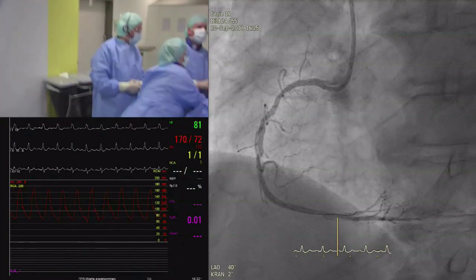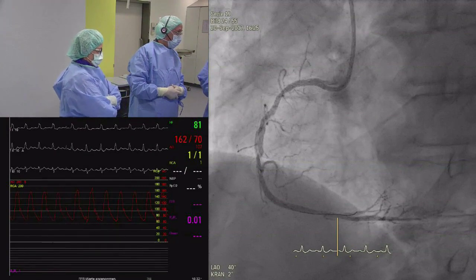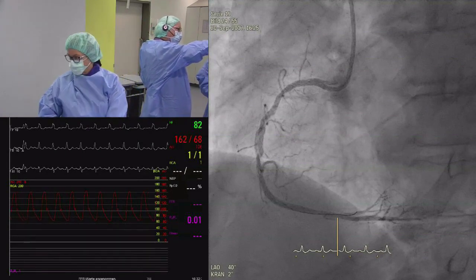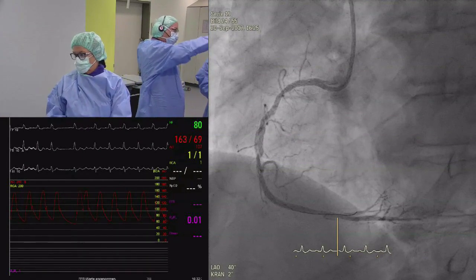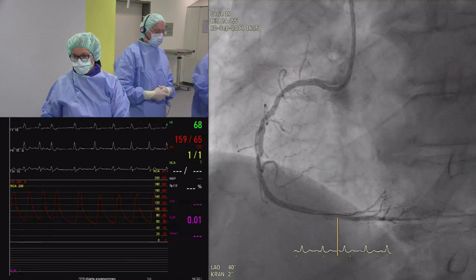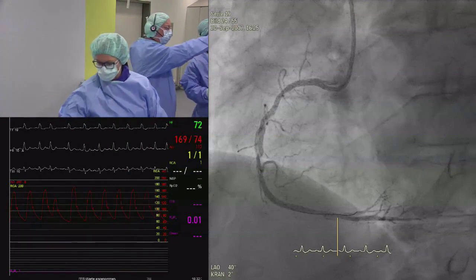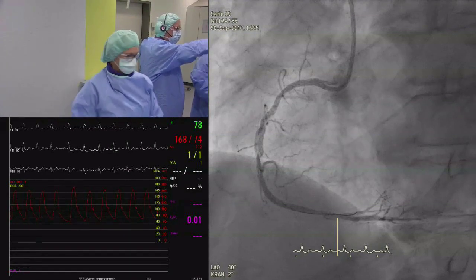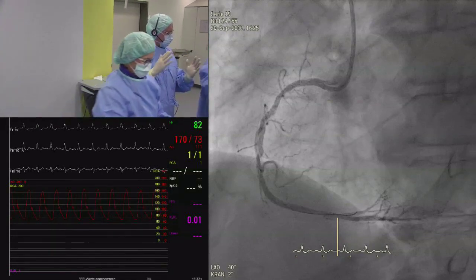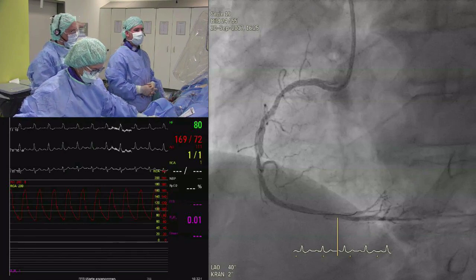So we were just discussing what kind of stent to go for. I would go for the 3.0 16, or we can go shorter. Yeah, I think 3.0 12. You could go, there is a little bit of disease more proximally. I would just cover that as well, and it makes it a little bit easier to find the right spot. Trying to position a little tiny short one is a challenge. And you can also concentrate on where the distal tip is and let the rest lay wherever. You can always post-dilate up in there if you think it needs to be expanded.